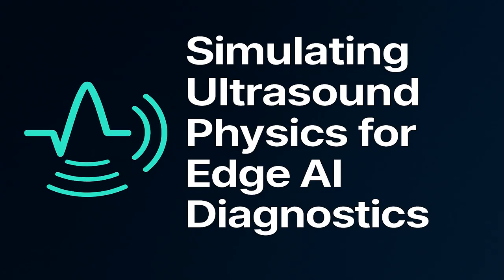And that shift to edge AI is really being driven by two unyielding forces in healthcare: latency and access. Let's start with latency. We need instantaneous diagnostic feedback. Absolutely. By deploying the AI engine directly onto the portable ultrasound device, you cut out the internet bottleneck entirely. This ensures extremely low latency, ideally below 50 milliseconds per frame. And that 50 millisecond threshold is crucial, isn't it? It ensures the system doesn't feel sluggish. It allows for true, real-time feedback.